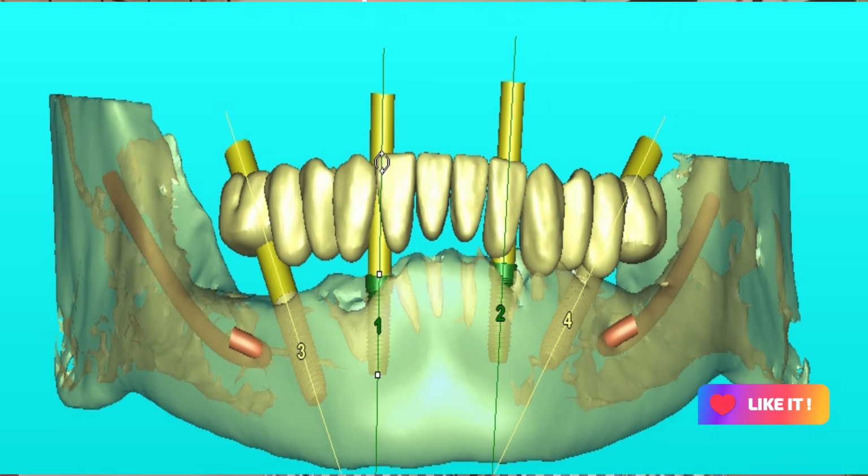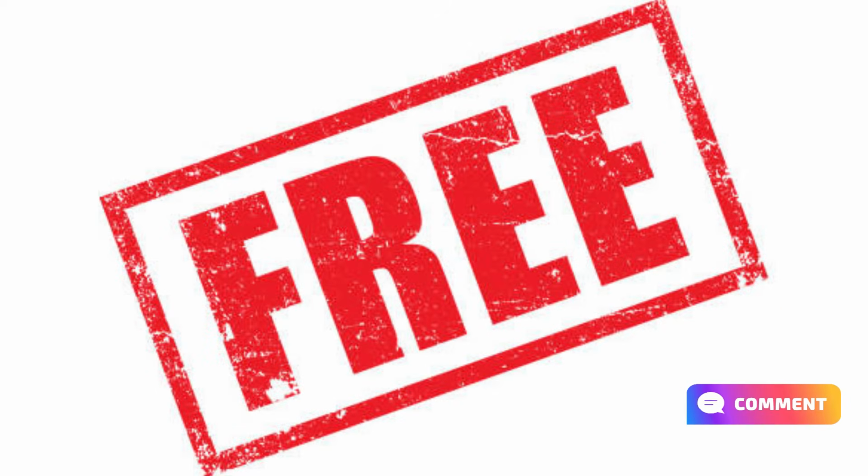So you have to take a proper impression. There should be no air bubbles. The pouring should be good. Nowadays the AI generated system is there, CAD CAM, with which you can easily fabricate the crown in your clinics as well. There are a lot of modern amenities available which we need to use nowadays. In our time there was alginate and nothing else. After that putty came, after alginate and putty, now it's AI generated. I know the cost is more, but now the lab persons are providing it for free or at minimal cost. So you can always tell your patient to wait for a day and do the crown preps.